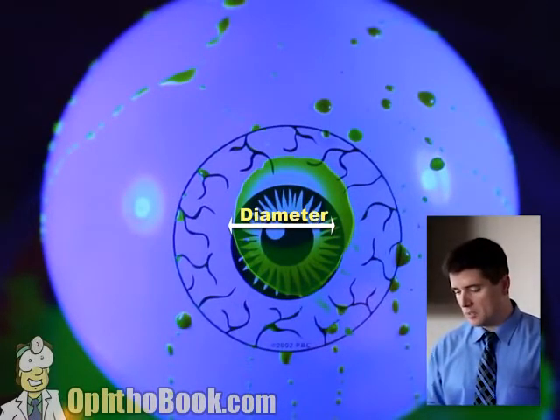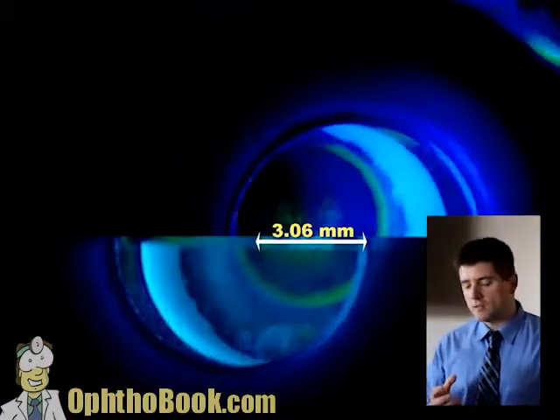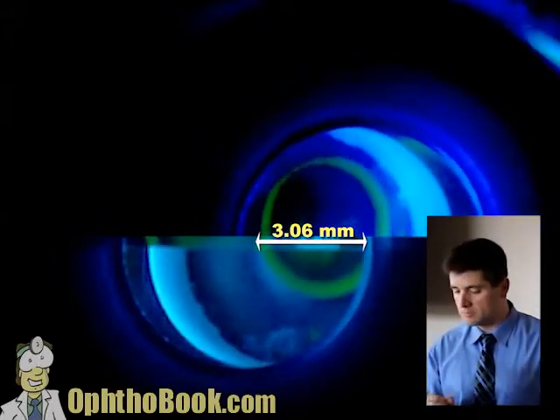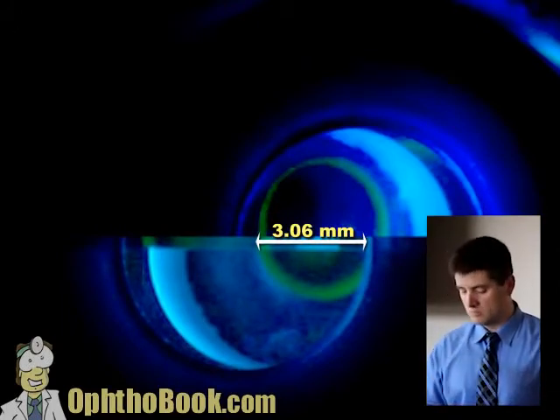And that's exactly what we do when we are messing with the eye. We're pushing on the eye, and we're trying to flatten a circle on the surface of the cornea that is exactly 3.06 millimeters in diameter. So you're pushing and trying to get it to 3.06 millimeters, and that's when you know you have it perfectly.